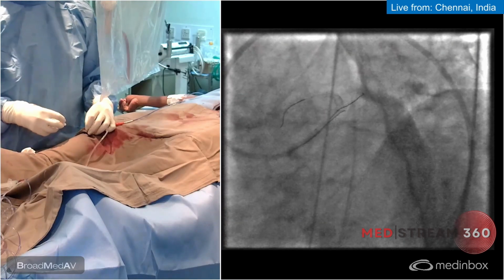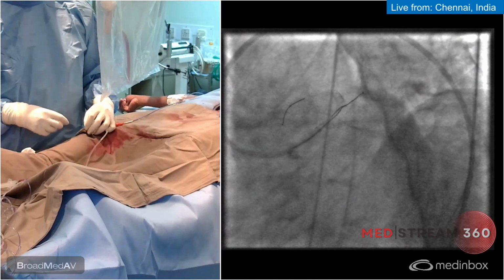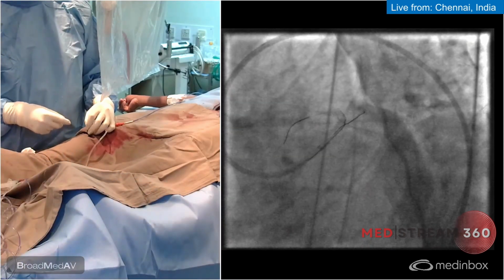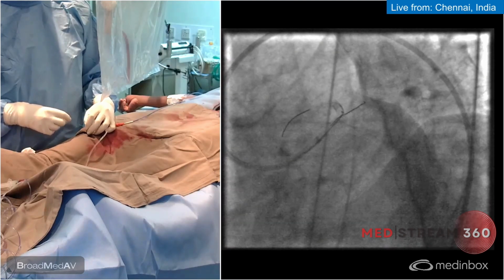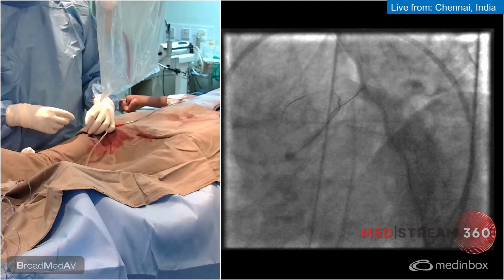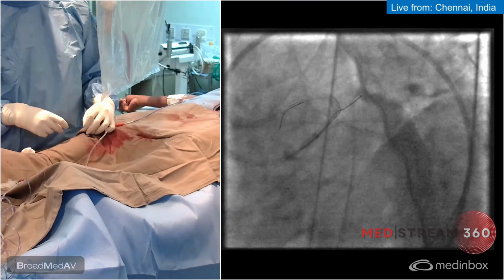I'm going to try for 5 minutes. Like Nanda said, the flow is still there. I don't want to mess around. The other options are taking a dual lumen microcatheter and trying. I don't think there's any ST change or any discomfort. Or another option is to keep an IVUS live and we can try to identify the ostium and we can wire.